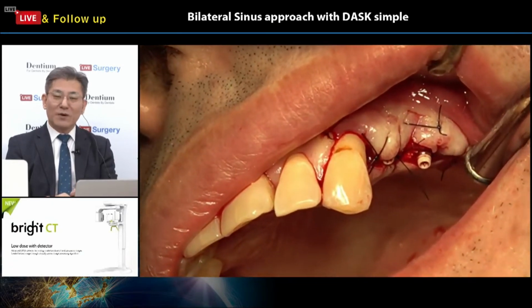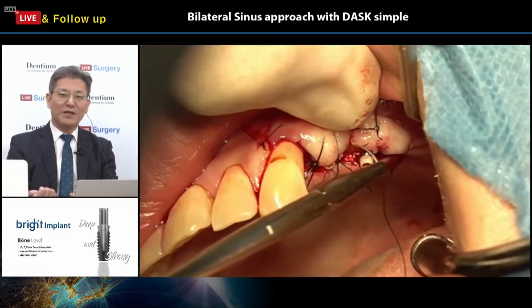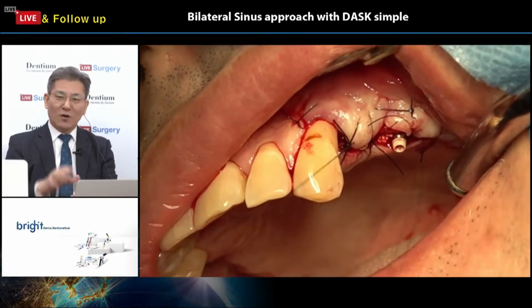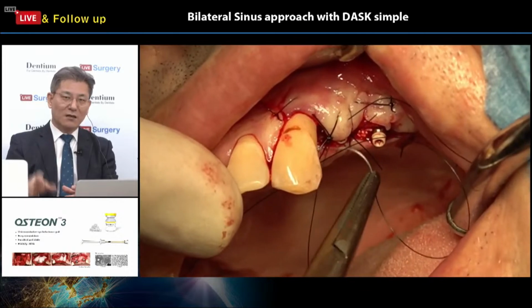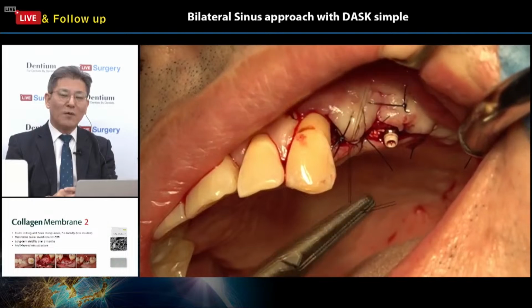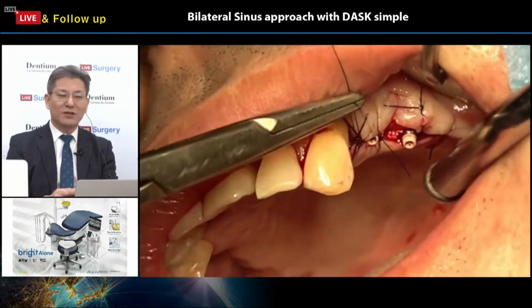The source is alloplastic. The Osteon 3 is an alloplastic graft material. There are many collagenized bones now in the market, bovine origin, porcine origin, right? So the collagenized bone is prevailing now. So we can choose depending on the style, the defect, and the purpose: alloplastic collagen, bovine collagen, porcine collagen, it doesn't matter. Dentium is launching a bovine source graft material, the Osteogeno, right? Now we are able to use this Osteogeno in Korea.